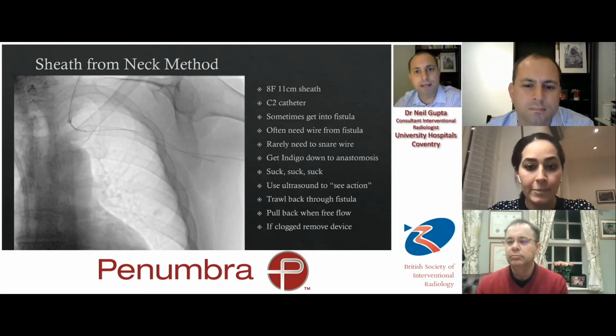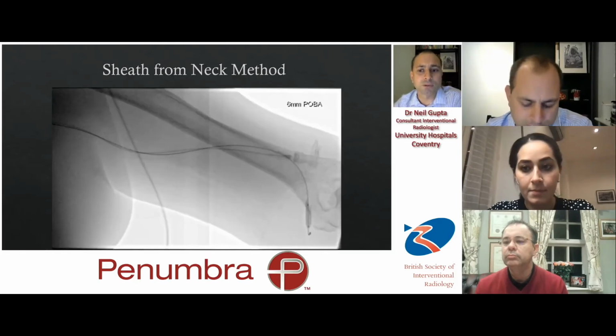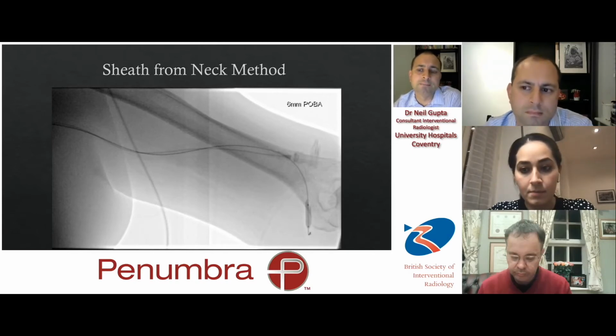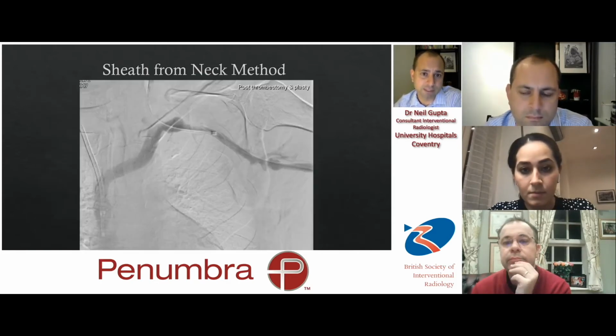You need to keep trawling back and just keep doing that all the way through until all the clots are removed. Once all the clots are removed from the fistula, then pass a balloon all the way back down to the stenosis. And I normally choose a 6mm by 2cm balloon, and I trawl that through the fistula. And normally that will get snagged on the culprit, the underlying stenosis. And then I know where to then plasty to ensure a good flow. And you get these lovely pictures at the end. This is a graft, which is why it looks so nice. Which then you clear, and obviously this is the neck puncture with the 9 French sheath or the 8 French sheath popping down, round, back down that subclavian.